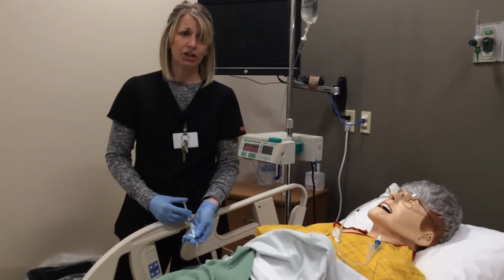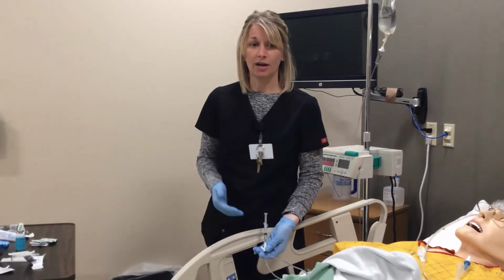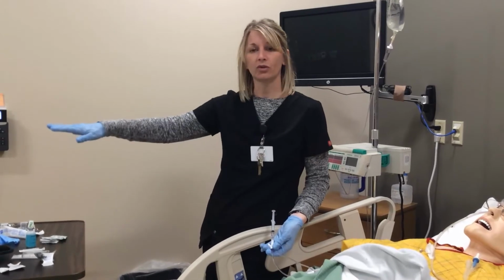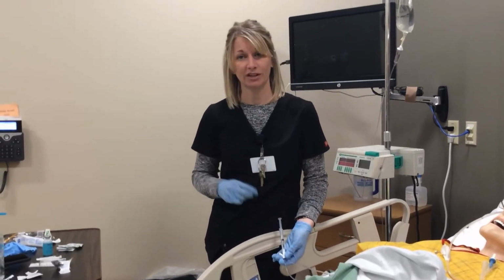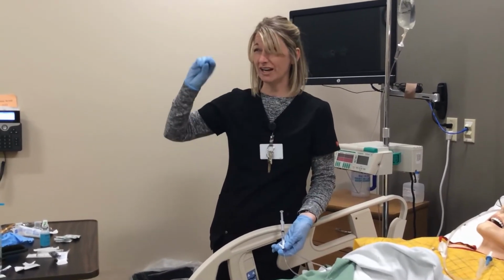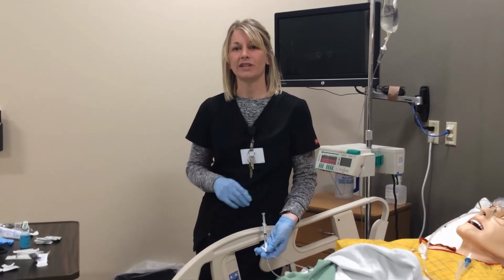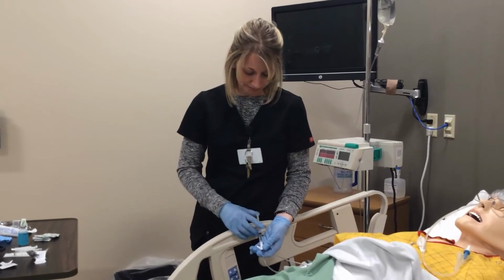So let's say you get orders for medications that maybe you need to push over 10 minutes. You're going to verbalize that to your instructor. What the instructor will probably do is have you push it at a slow rate. They probably aren't going to sit there for the full 10 minutes while you push it. They are going to watch you push it at that slow rate, looking at it, being like, okay, yeah, they're going to get it in there at around the 10-minute mark. And they may say at like a 3 or 4 minute mark, okay, for sake of time, we're going to say that you've pushed it in over the 10 minutes. So just so you're aware.